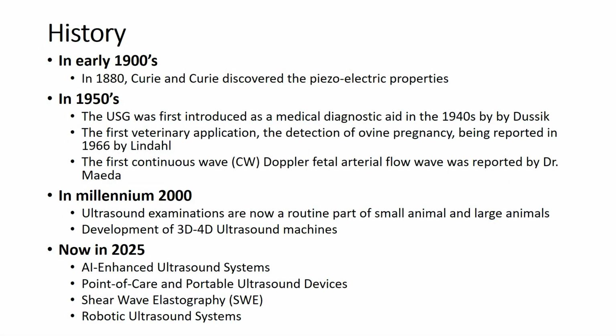He used A mode, or the amplitude mode, for the diagnosis. The first veterinary application of ultrasonography was in sheep for detection of pregnancy in 1966.